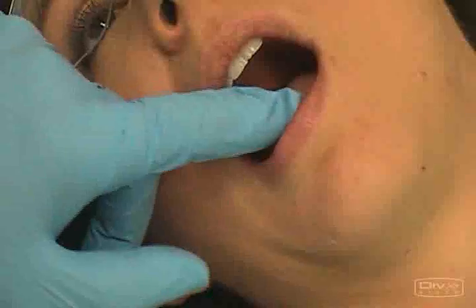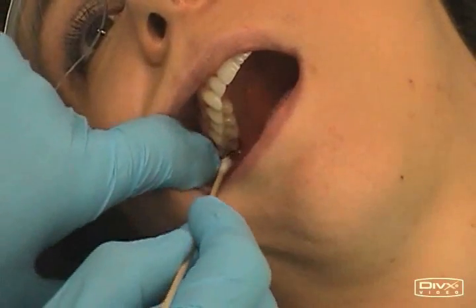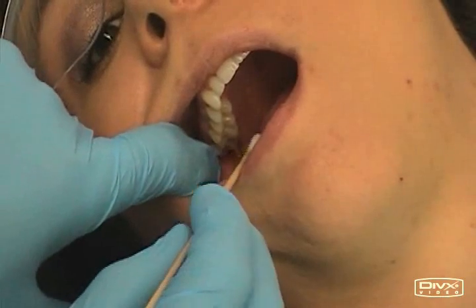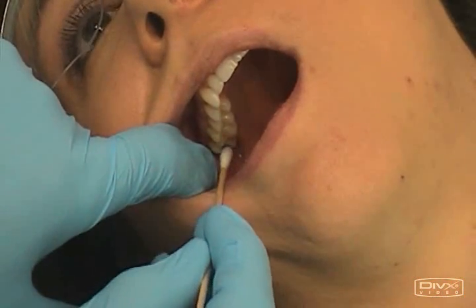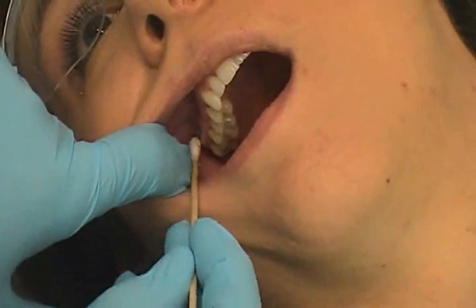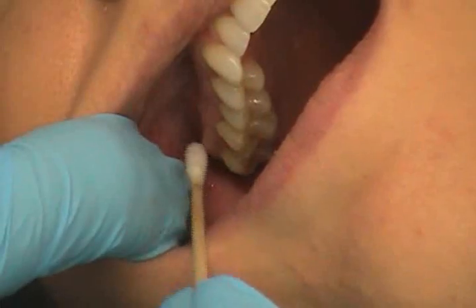Posterior superior alveolar nerve block. The nerves are the posterior superior alveolar and their branches. The areas anesthetized are the pulps of the maxillary first, second, and third molars, the buccal periodontium, and the bone underlying these teeth. The needle gauge and length is the 25 or 27 short.